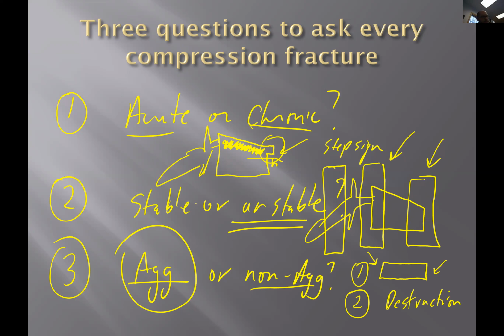Does this help a little bit? Any questions or comments before I move on? Hey, Jeff. Yes. So back to the step sign. Yes. Is it possible then, if I'm understanding this correct, that there could be no step sign and it could still be acute?